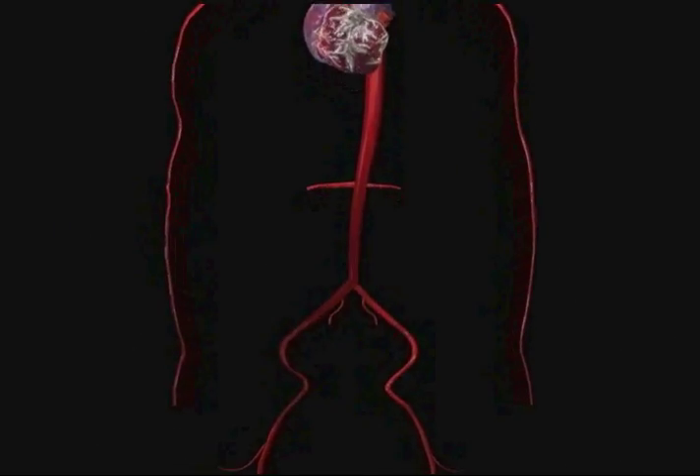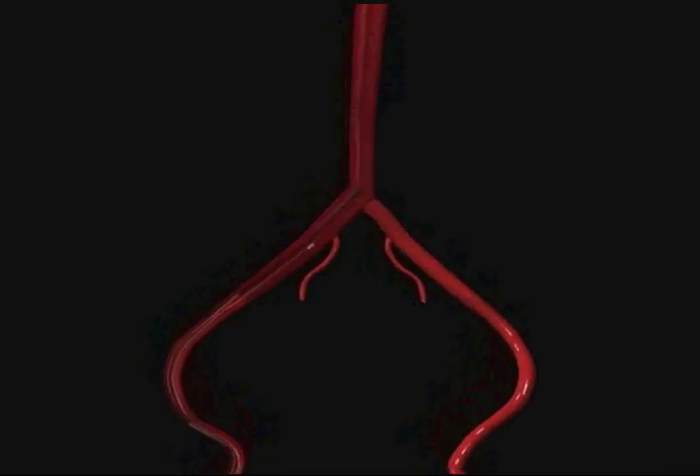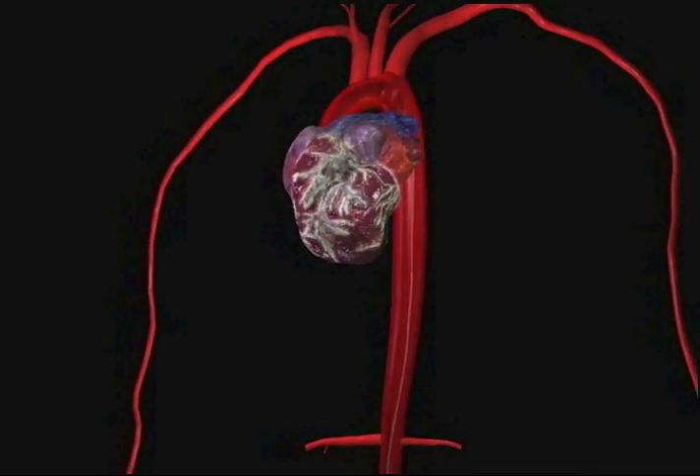Avoid using excessive force while inserting the balloon. Continue to advance the balloon until it is positioned in the descending thoracic aorta, with the tip just distal to the left subclavian artery.